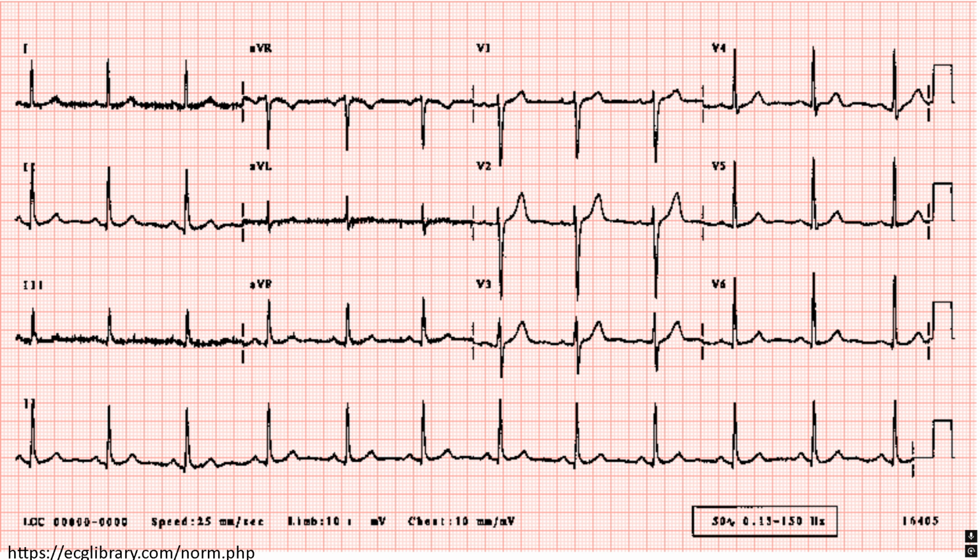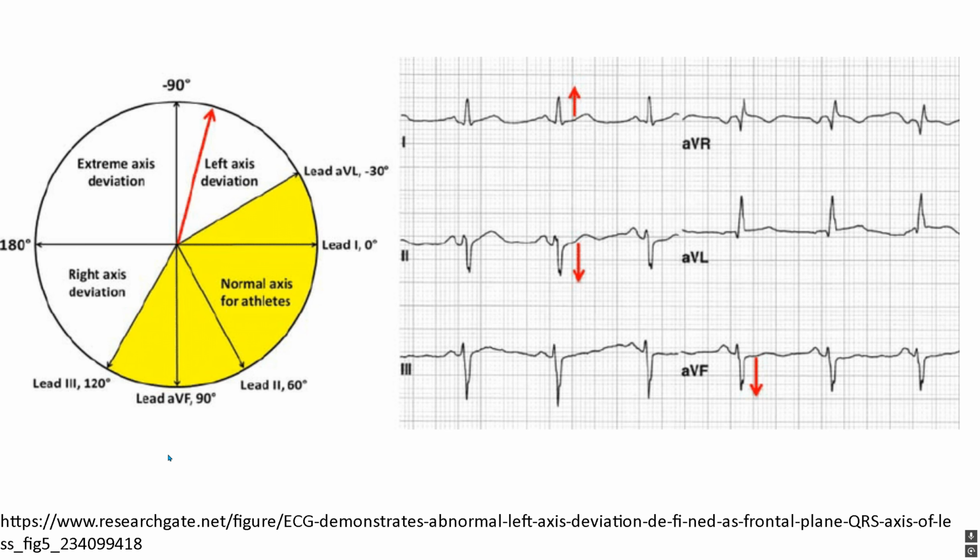Lead 1 is your left thumb, aVF is your right thumb. If your left thumb is up, left axis; right thumb is up, right axis; two thumbs down, indeterminate; two thumbs up, normal. All right. Again, here's an example of it, okay?